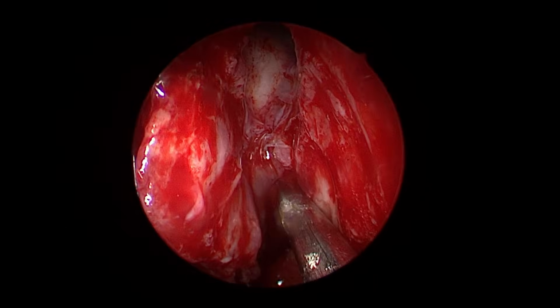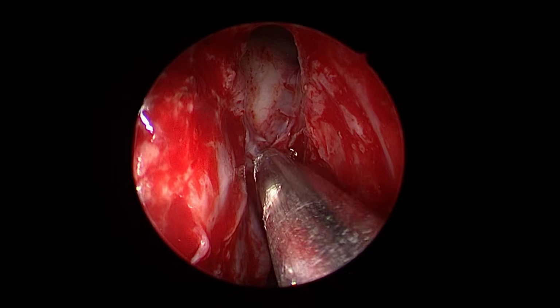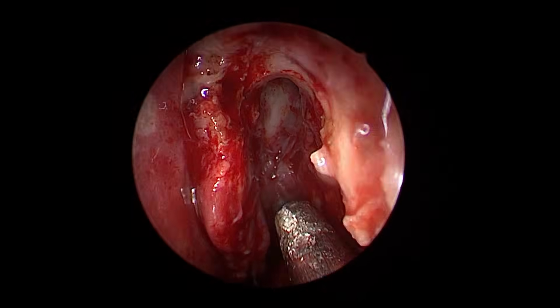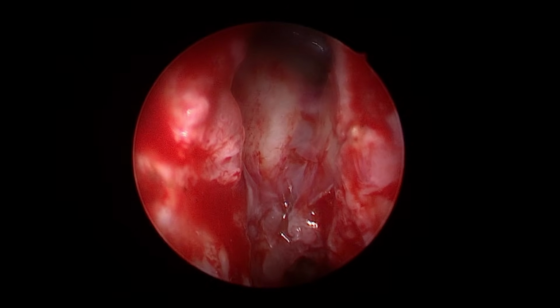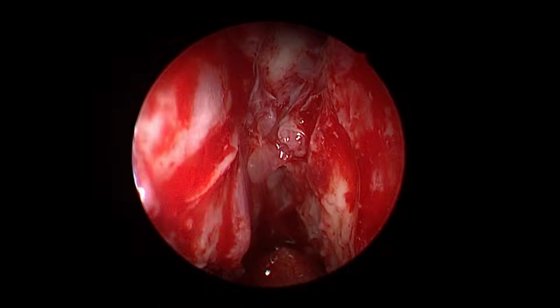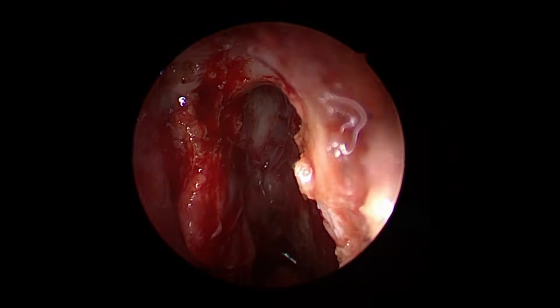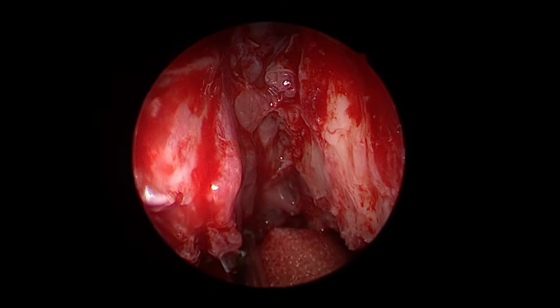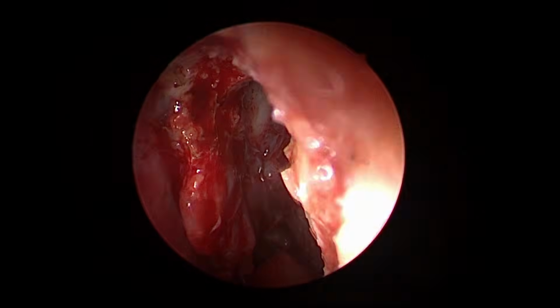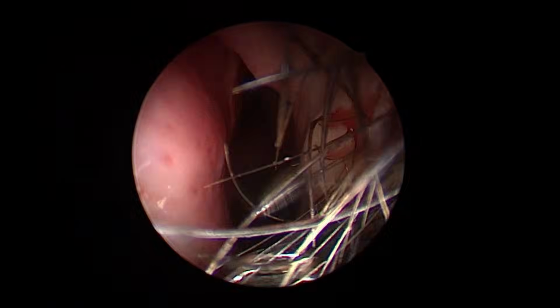That is my criterion of adequate frontal sinus opening. Assess yourself. Had I not removed this beak, it would not have been possible. So judge yourself. I can feel now this is an adequate frontal sinus opening to push the topicals inside. Agreed? That's it.